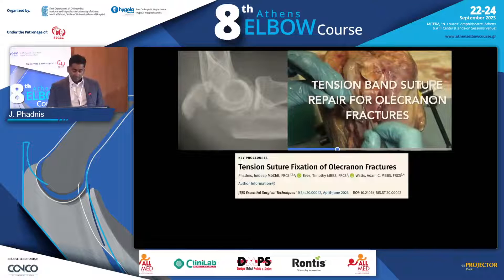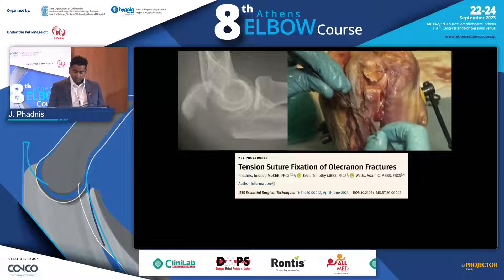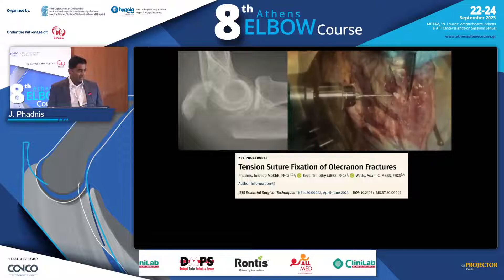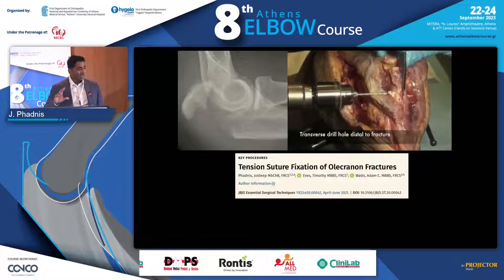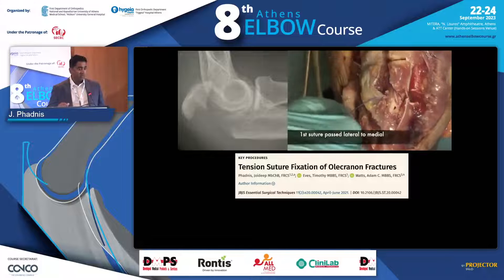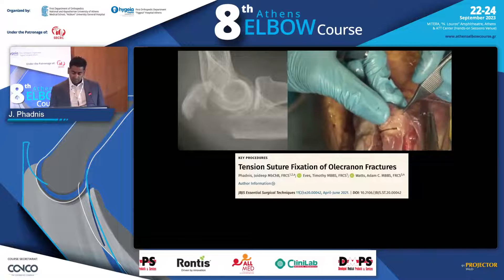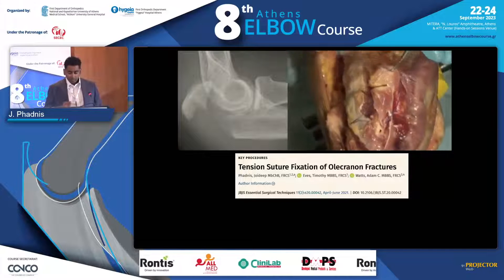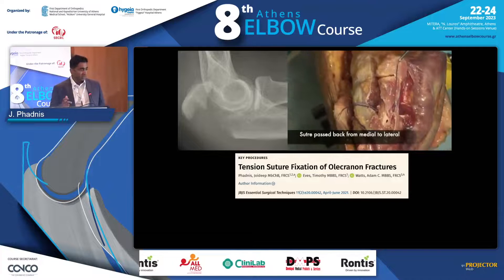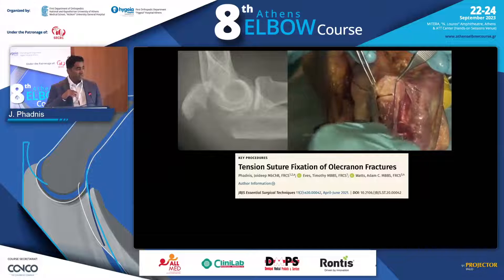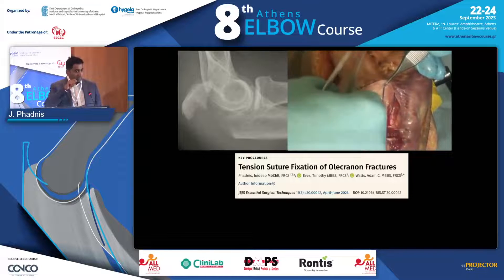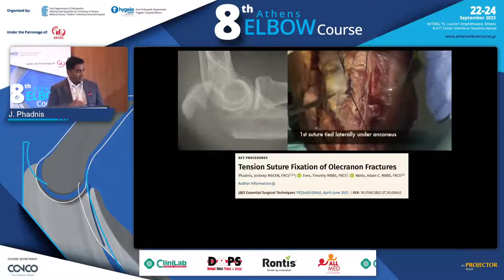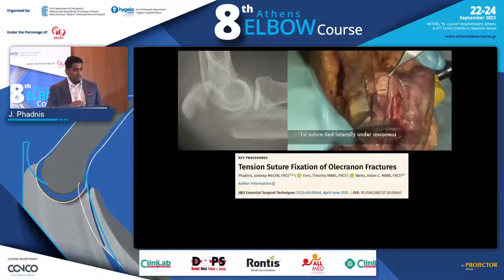I'll show you that repair in a cadaveric model — just to show the order of the sutures. It's a very easy, quick technique. The sutures always go from lateral to medial: they grasp the medial triceps, then come back through the transverse tunnel as you would for tension band wiring, then grasp the lateral triceps. It's important to really feel the bone through the tendon insertion. The reason sutures always initially pass from lateral to medial is so that the knots remain away from the ulnar nerve.